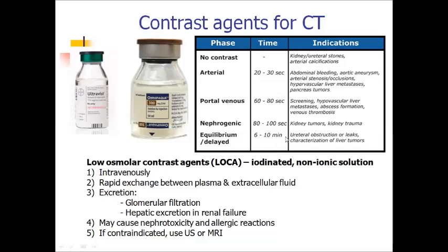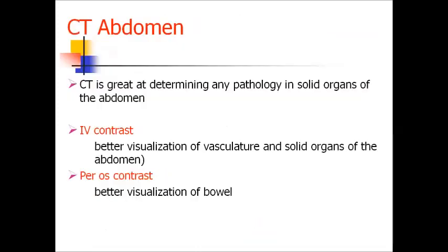So the whole time for examination does not exceed 15 minutes. It's very fast, of course.